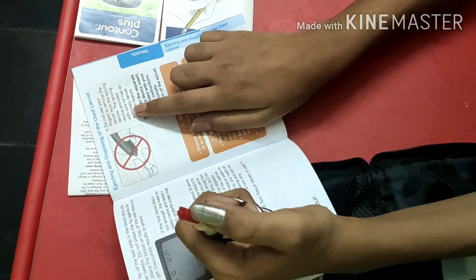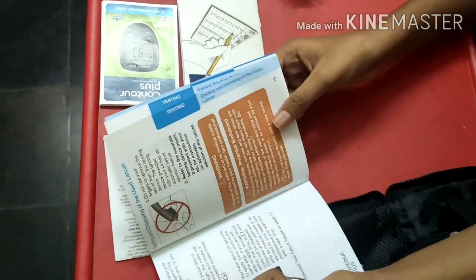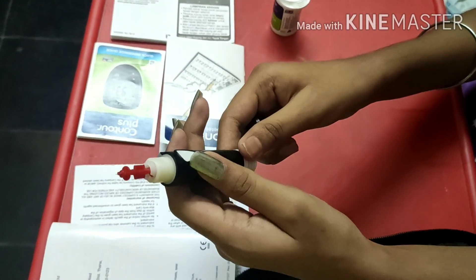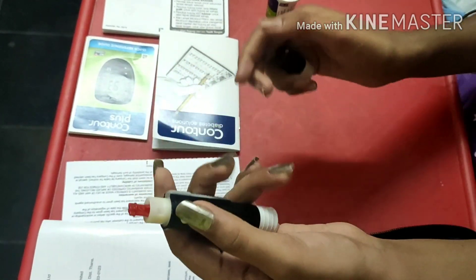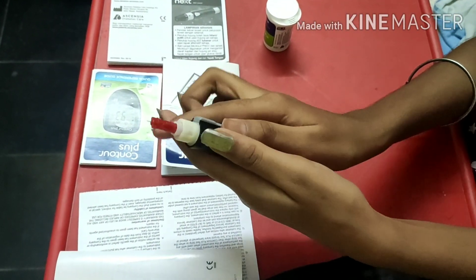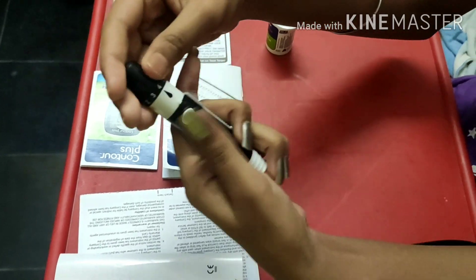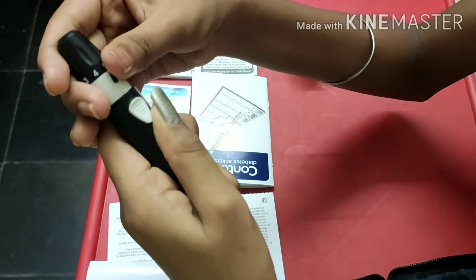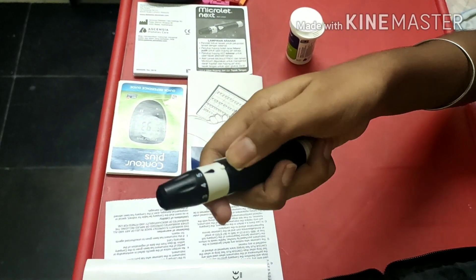Don't touch the needle directly — that is a warning. To set it up, you should pull, but you should not push directly. You should click this to cock it. Then again align with the mark, pull, and click on it.